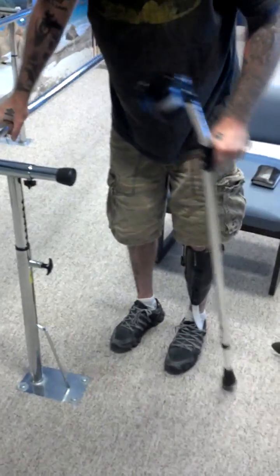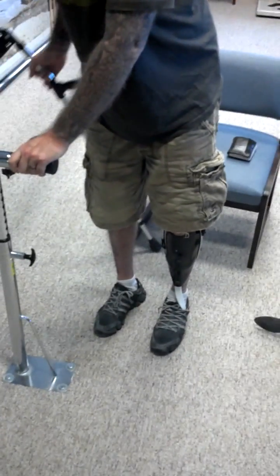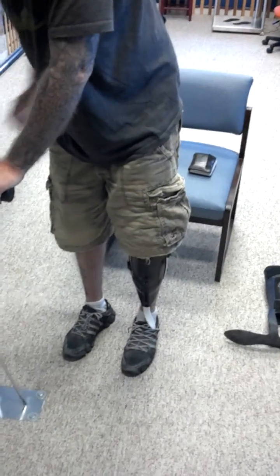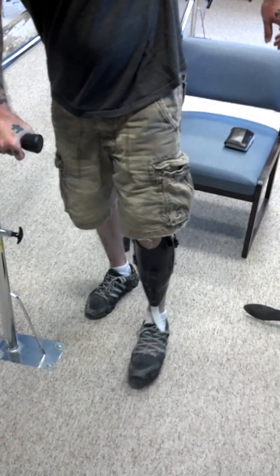All right, let's go ahead and take some steps. We'll go in between the parallel bars so you have both hands to hold on to and let you get used to that sensation. Now like with that toe-off where you really lean into it to get that spring, do the same thing here — lean into it and let that carbon fiber work for you.